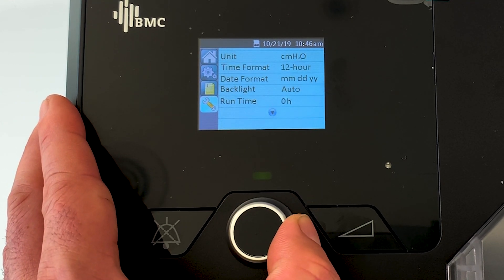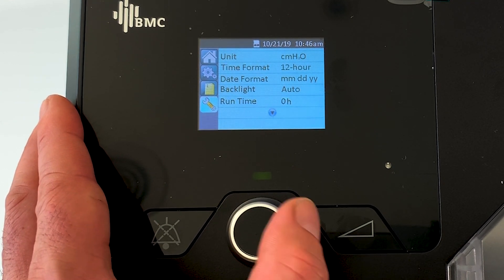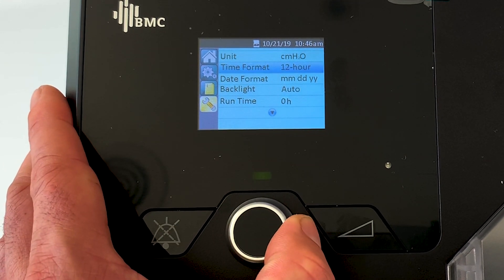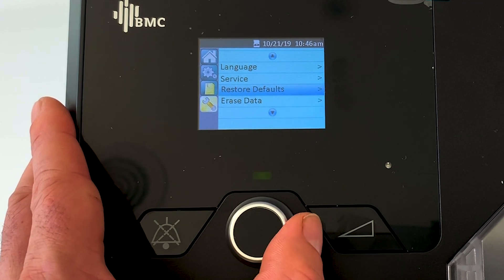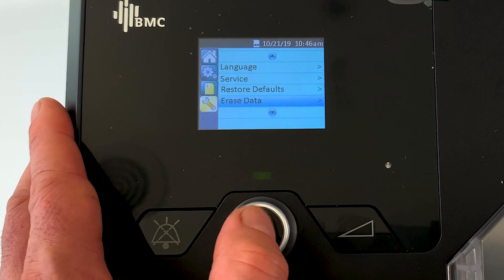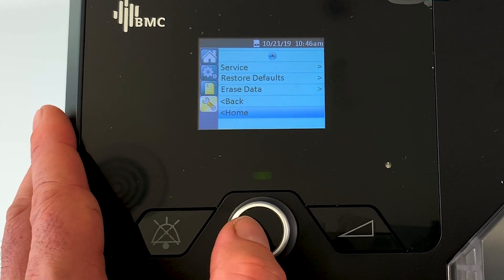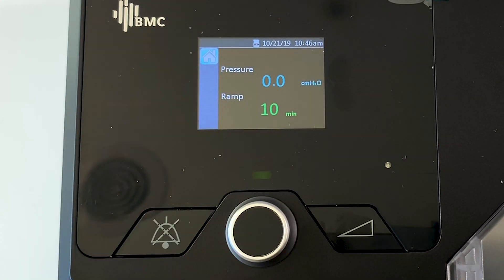Then we've got back and home. If we go back, we've also got another spanner menu here. You really don't need to change any of this stuff, but it's there - you can restore defaults, you can erase the data, that sort of thing.